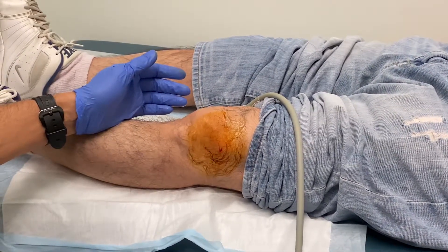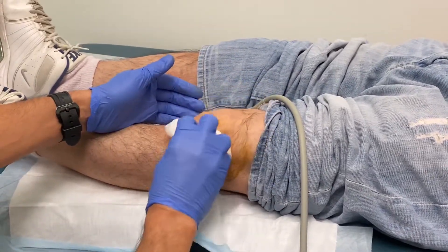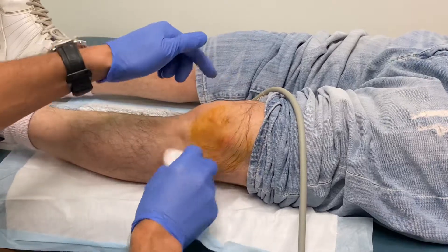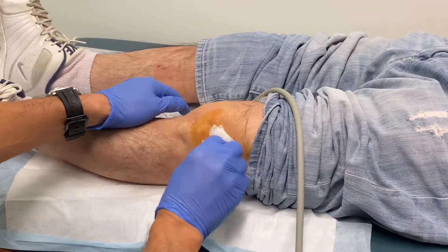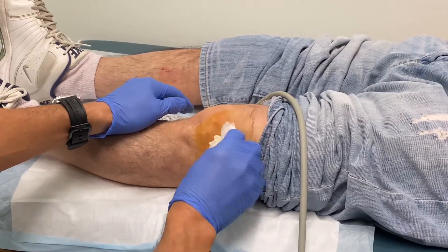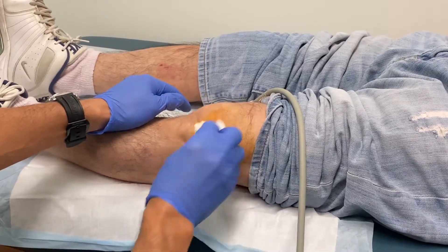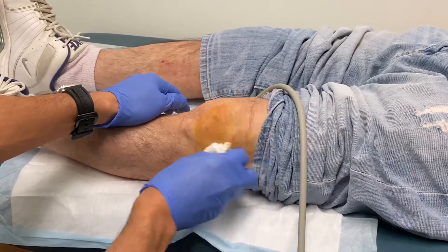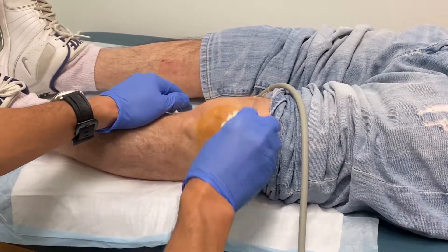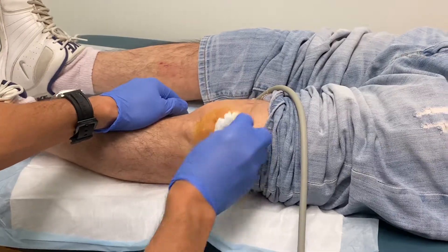So that's pretty much it. That was a platelet-rich plasma injection for the treatment of osteoarthritis, showing you my technique — using the probe to confirm placement of the needle and using a particular technique that reduces the amount of pain. 27-gauge needle for skin and subcutaneous tissue; I don't inject lidocaine into the joint because it may actually alter the function of the platelets. Dr. Mora here showing you injection of a knee with platelets. Thank you.